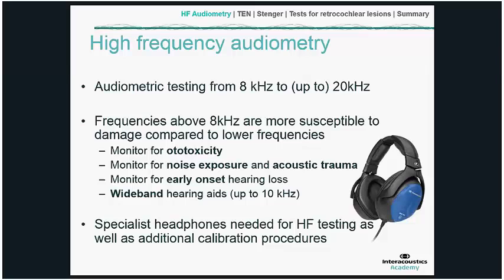And some of these are listed here. So for instance, there might be a clinical need to monitor for the early onset effects of ototoxic medication, which can be administered for a range of reasons, but a common one would be anti-neoplastic drugs for cancer treatment patients.